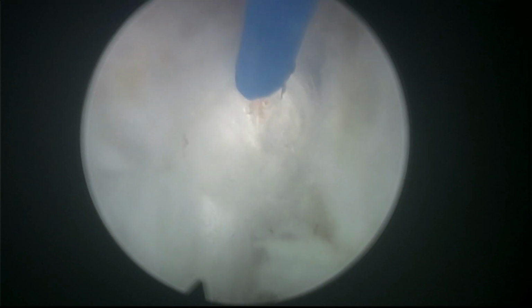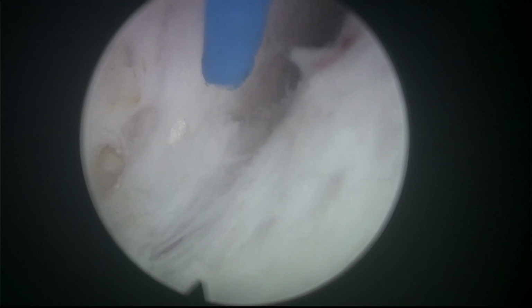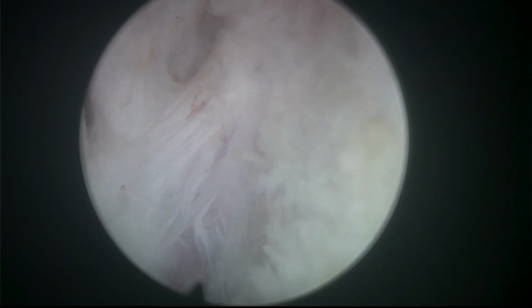You find sometimes slightly more difficult angles or areas that make you sweat a little bit, but if you are calm, you will get to the end of it. I think, because I don't exactly remember, this was a problem with the fiber, so I had to change it or something. I don't remember what happened during the procedure.